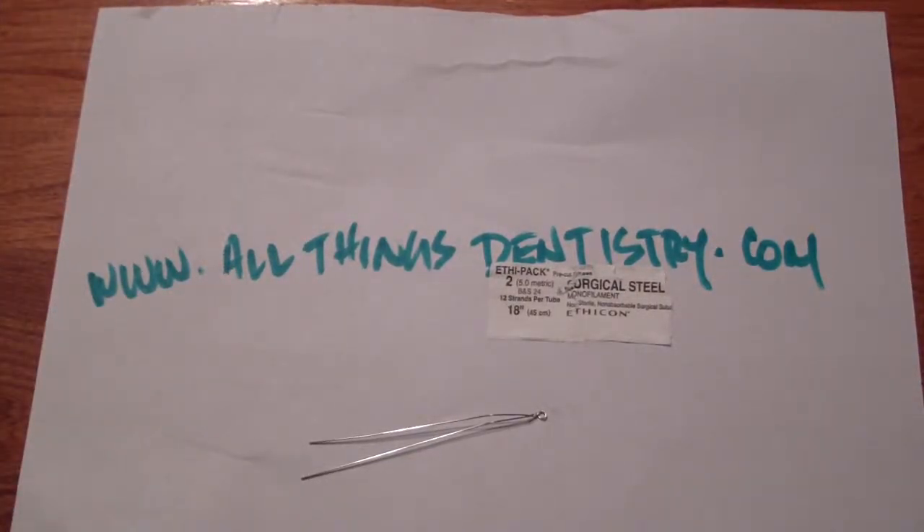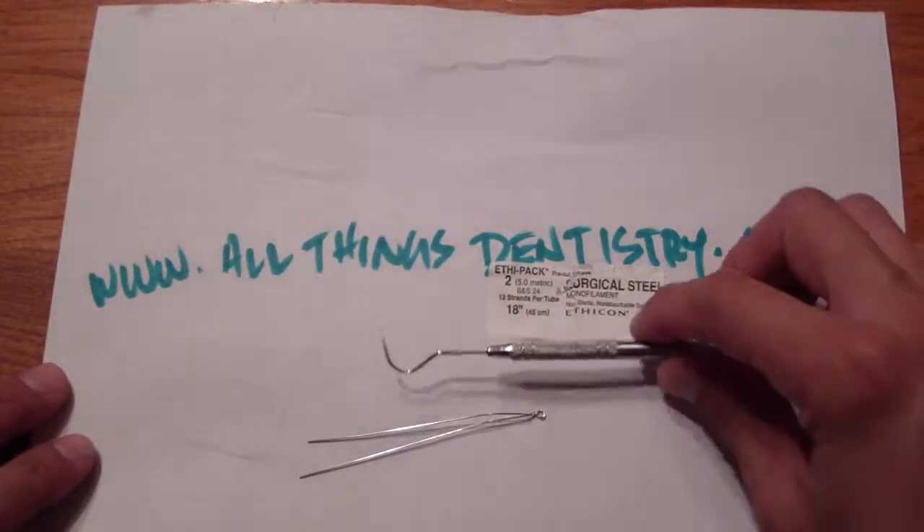Hey folks, Ashley here at the dining room table Saturday night. I just wanted to go over briefly a case I did this morning — my first mandible fracture that I treated by myself.